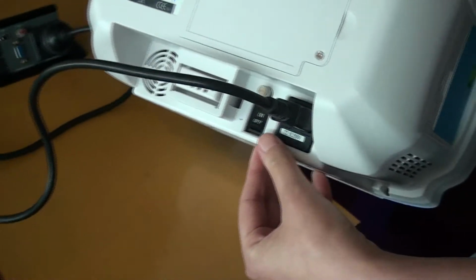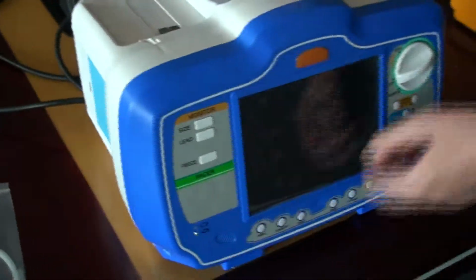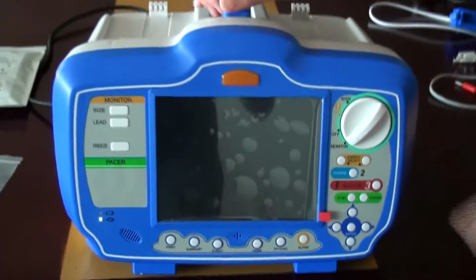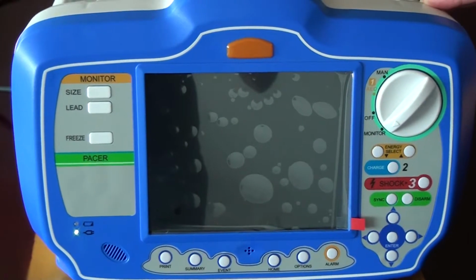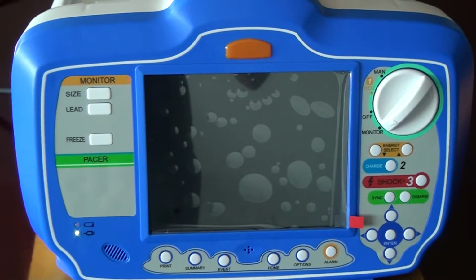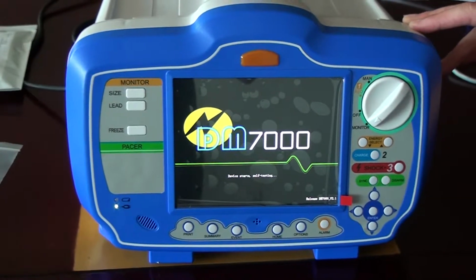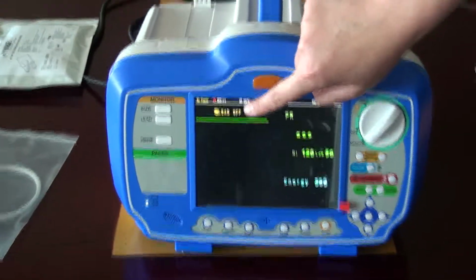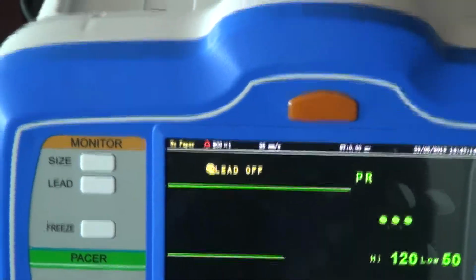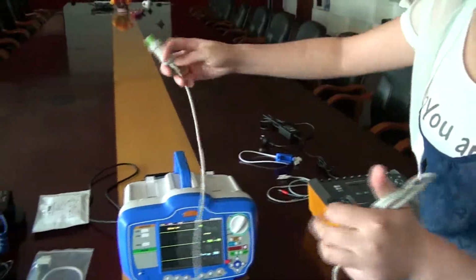Now we turn on the device: put the power source and turn on. Enter the monitor. Now it shows lead off, which means that we need to connect the ECG cable. Now we connect the ECG cable.